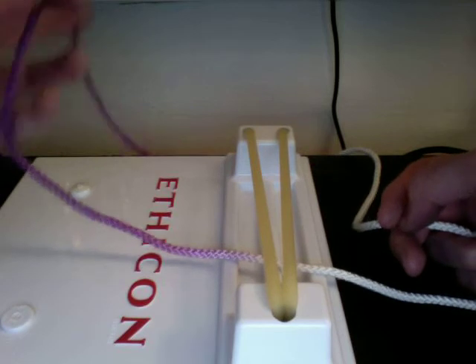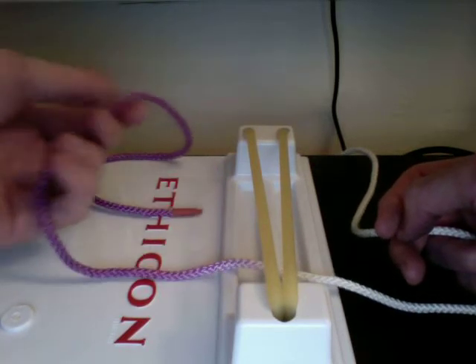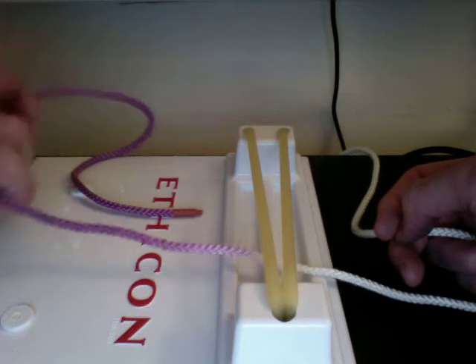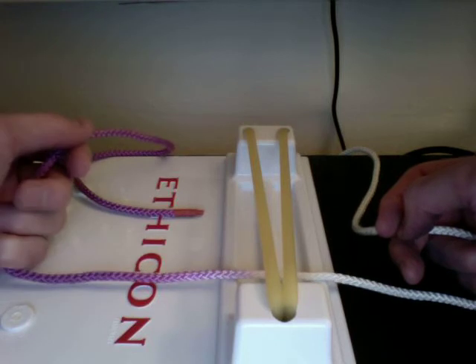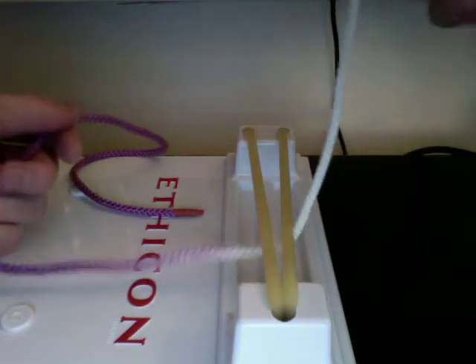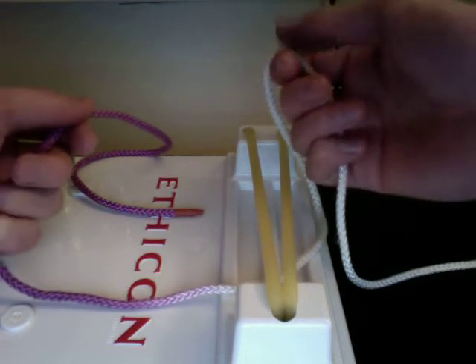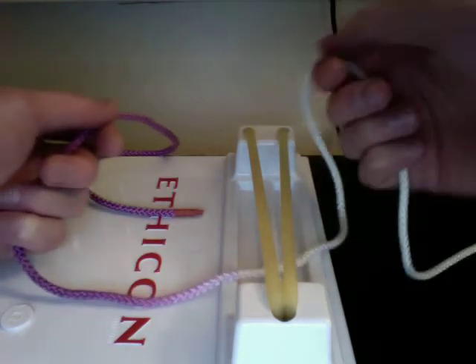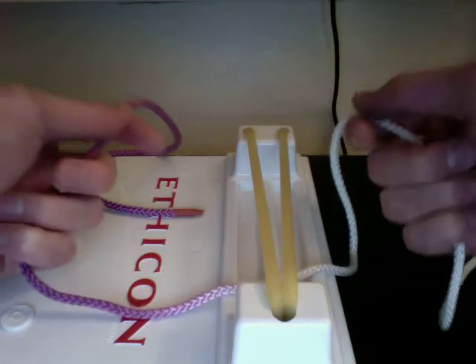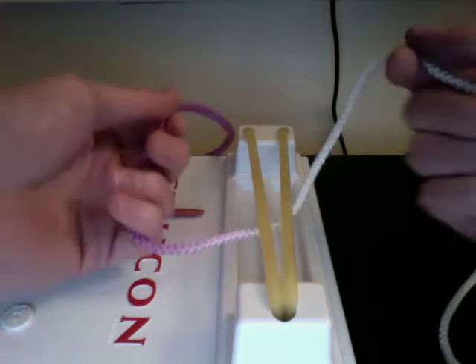To set up, you're going to have the left string — the purple string in this case — going away from you, kind of over your index finger, with the free end going in that direction. For the other hand, you're actually going to reverse it. I like to hold it so that the free end is going past my pinky. It's kind of a matter of preference, but it works very well for the setup we're going to be doing.